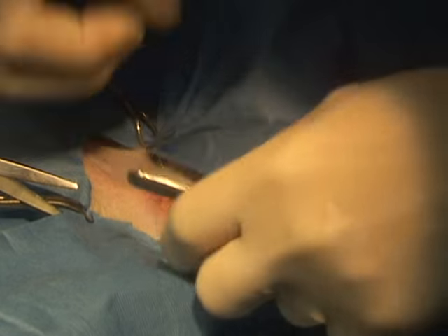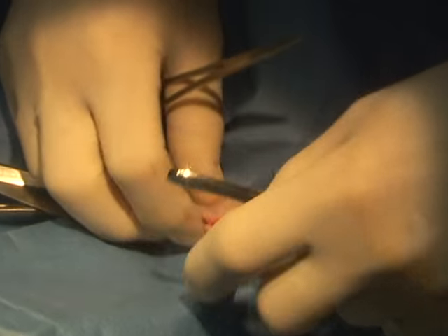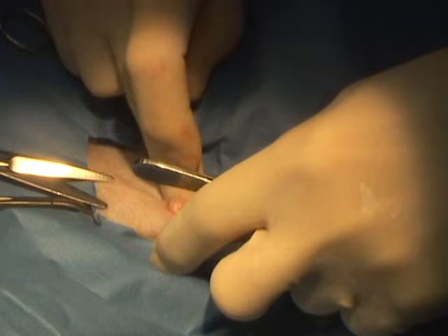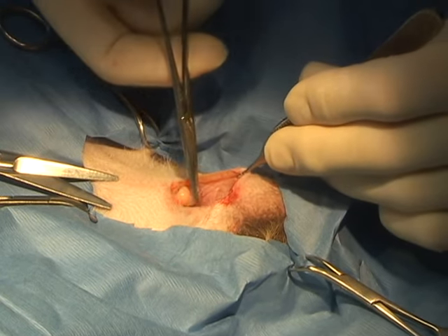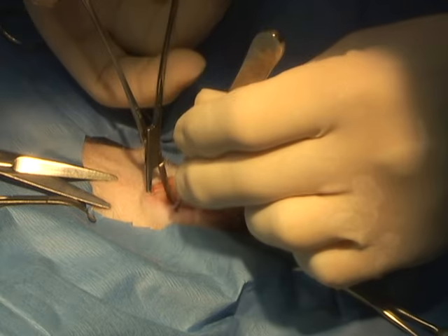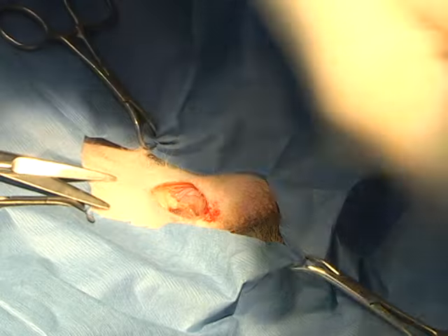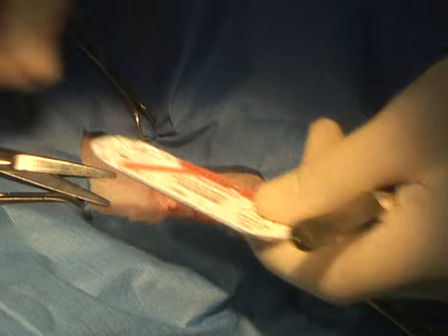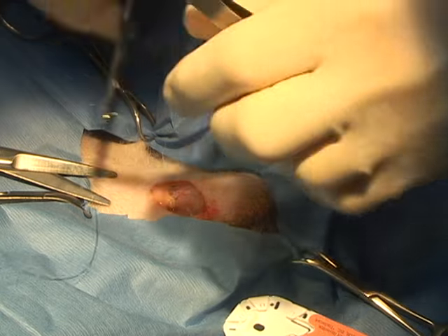We wanted to make sure that the epididymis was straight and parallel with the left testicle's epididymis also. That way, palpation-wise, they'd be the same. One thing that is interesting: if there was ever any question about this dog on an ultrasound, it would be immediately obvious that the testicles are not the same. But when you palpate this dog postoperatively, even though we didn't have a vaginal tunic to put this Neuticle in, it's very, very difficult to tell which side the Neuticle was and which side the original testicle was on.